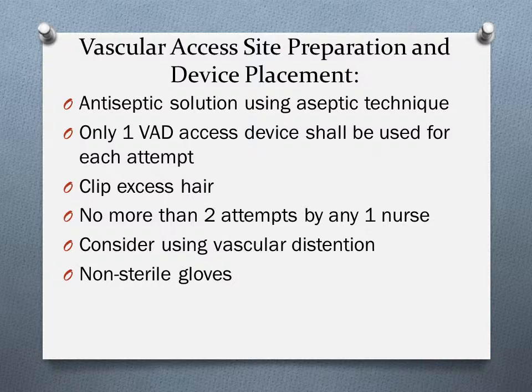Difficult vascular access requires a careful assessment of the various available sites and collaboration with other healthcare team members.